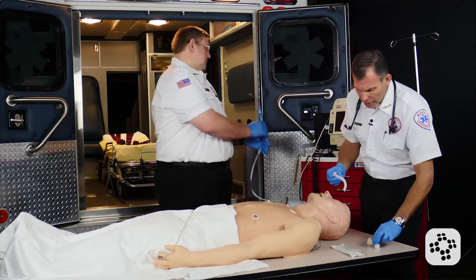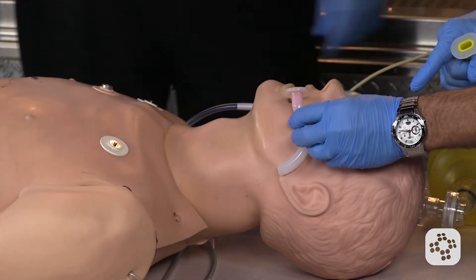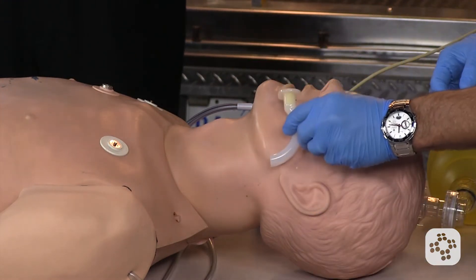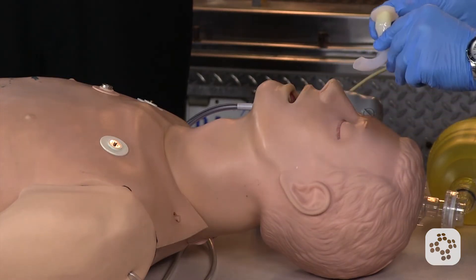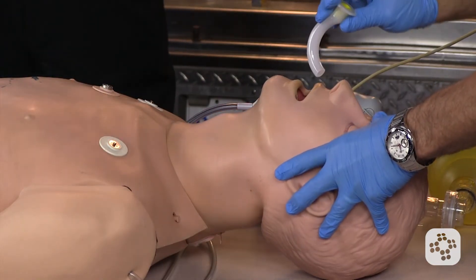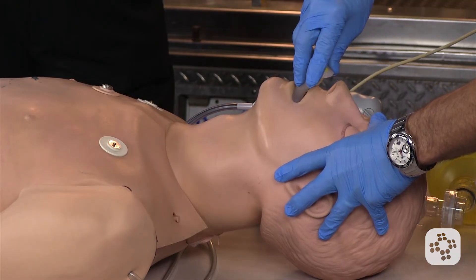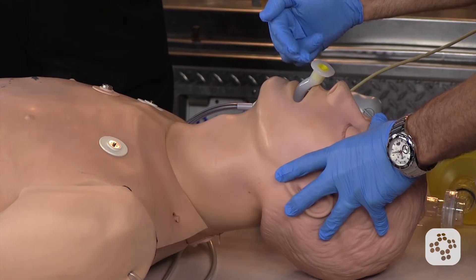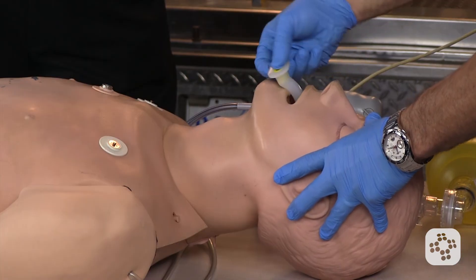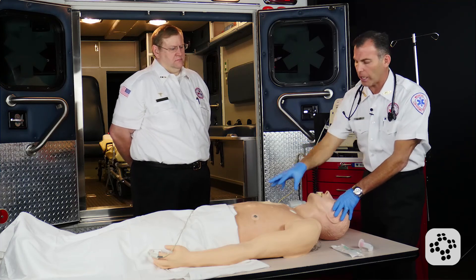In measuring this oropharyngeal airway, we're going to go from the corner of the mouth to the ear lobe. As you can see, this red oropharyngeal airway is a little long, so I try the next size down and it's just about spot on perfect. The procedure for putting the OPA in is to invert the tube so that the end follows the roof of the mouth until it gets closer to the back of the oropharynx. I then twist it, which helps move the tongue out of the way, bringing it forward and allowing air to pass behind the tongue and into the lungs.